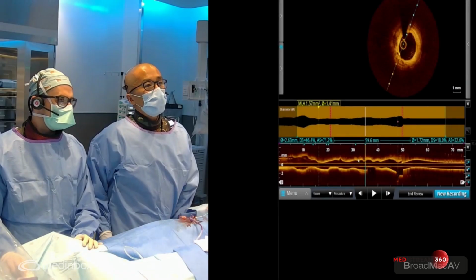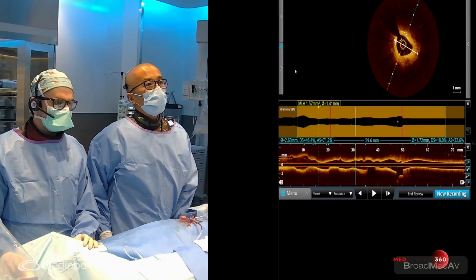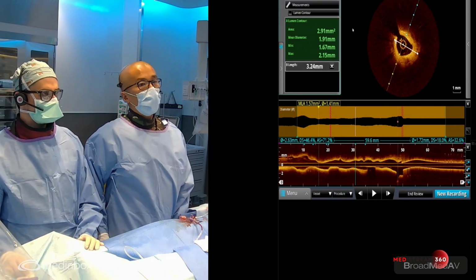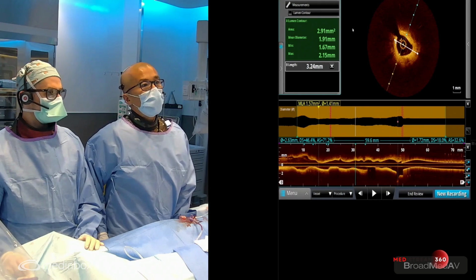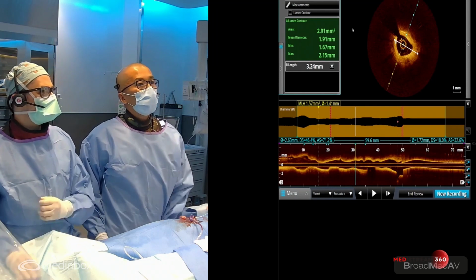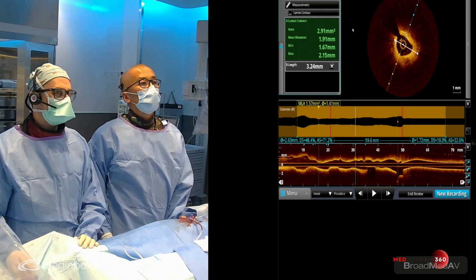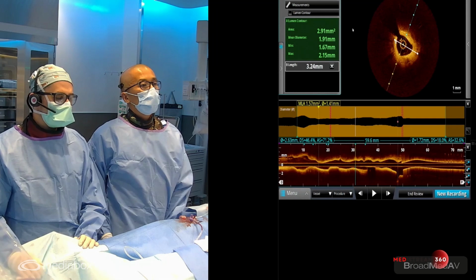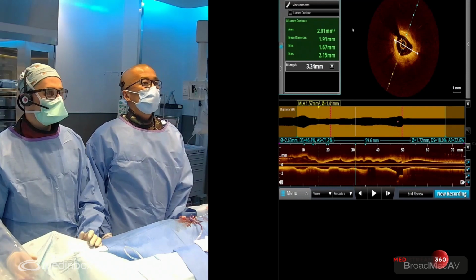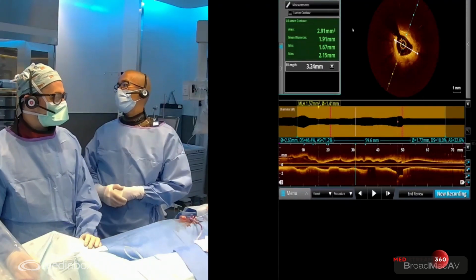Due to the information that we gained from this OCT run, I think it's clearly not necessary to proceed with atherectomy. And I think what we will do is POBA, plain old balloon angioplasty, and then move on until proven otherwise to IVL to really crack the calcium. And we also plan to use cutting balloons inside the stent just because of the severe intimal hyperplasia. So cutting balloons allow us to open up the scar tissue, improve the delivery, and also improve the expansion afterwards, and should be used in cases of intimal hyperplasia. So this is another area where the OCT helps us choose our balloon.